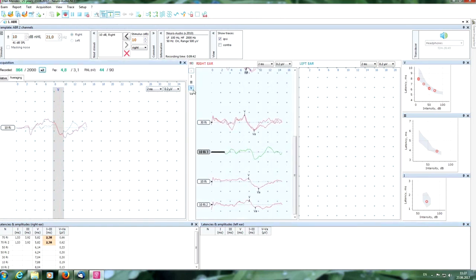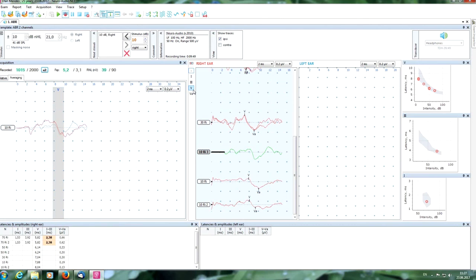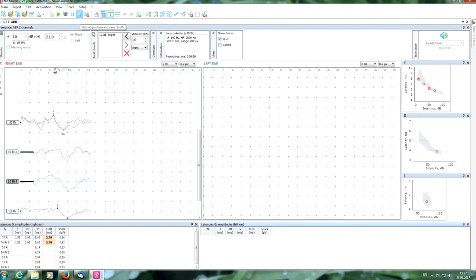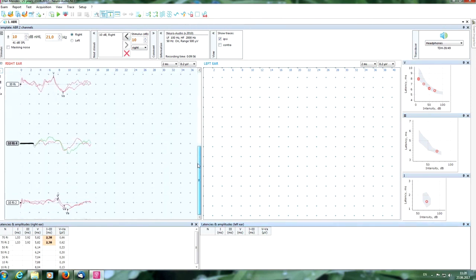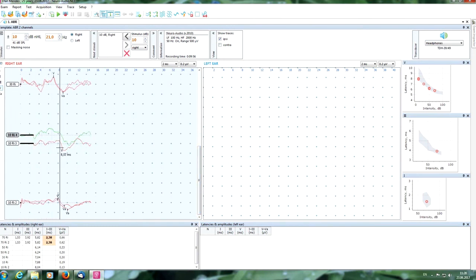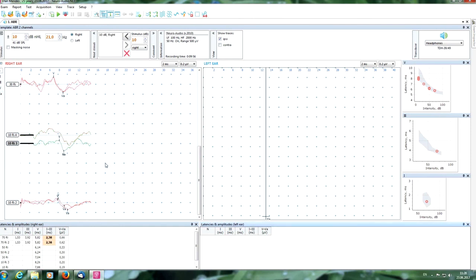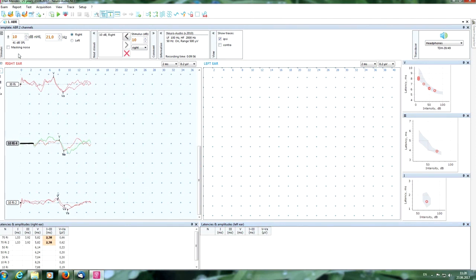You can see the good reproducibility. It is a fifth wave, not a noise. We have good statistical parameters of signals and we can stop. Put the markers. Overlay. Amplitude enough. So we have a patient with normal hearing.